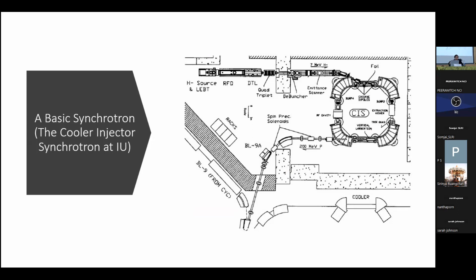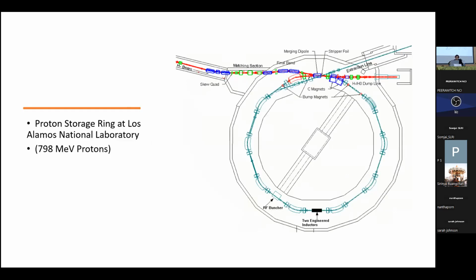So this is a basic synchrotron. The protons come out at 200 MeV. We sometimes say per nucleon when we talk about ion therapy. You see it has 4 of these big bending magnets, 4 of those dipoles. It has an injector. So the system that some of you went to see in China would look very similar to this. There's a source, a LINAC to inject it in, which we'll talk about more in a bit, and an extraction.